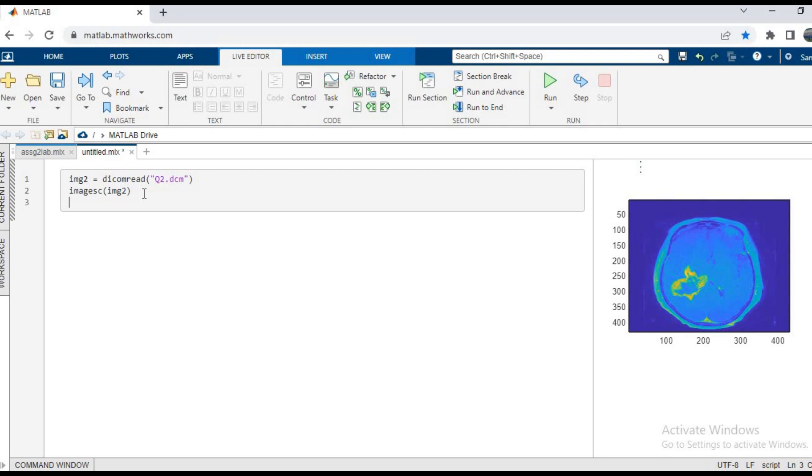How it has been taken, which is a very important part of the medical images. So we'll use the function dicominfo, and we'll put dicominfo bracket q2.dcm, that is the file name.